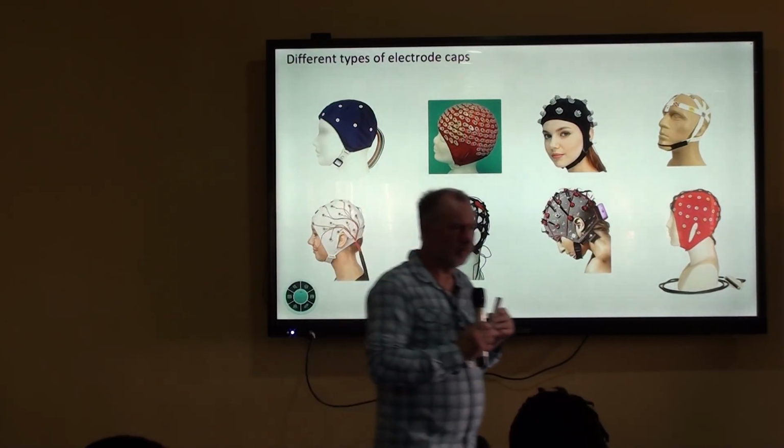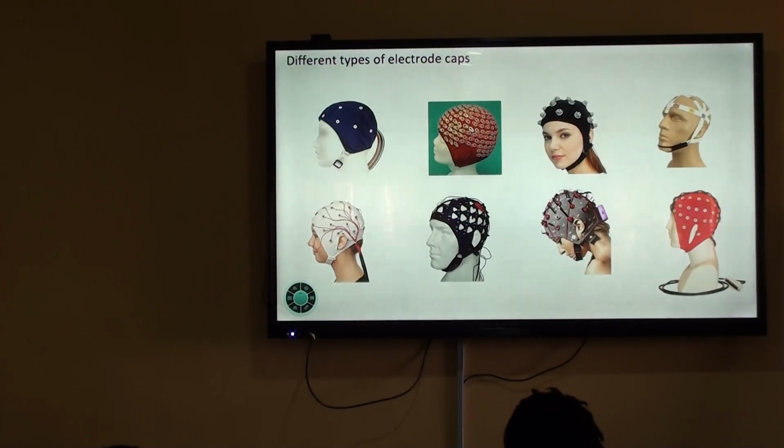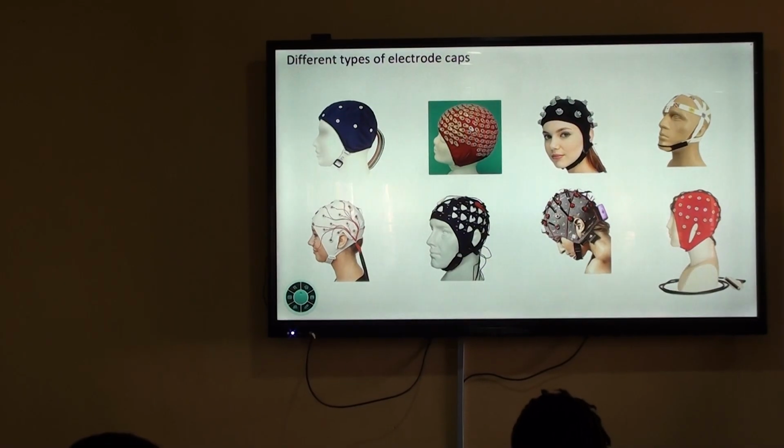I was going to say, like the Holter ECG, can be wired to a patient and it can go home. Yes, so it can also be applied that way. No, so most of the systems that I'm showing here are systems that you would use in a laboratory environment for research purposes, so not for clinical purposes.